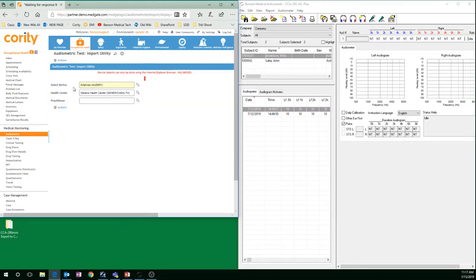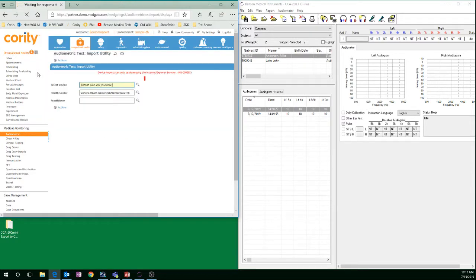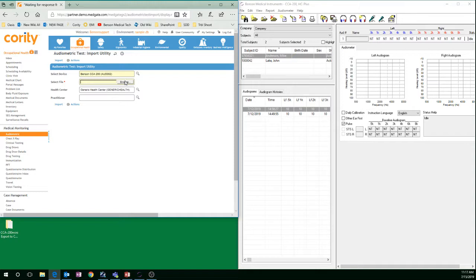For the device, click the magnifying glass. Go to Benson CCA 200 and click the Equipment Code. The Select File feature will appear on screen when you select that Equipment Code.